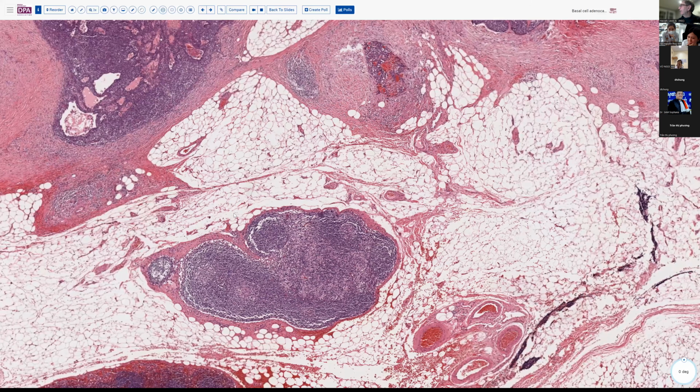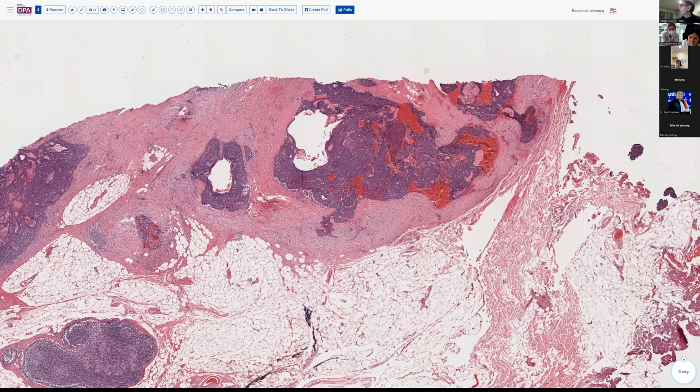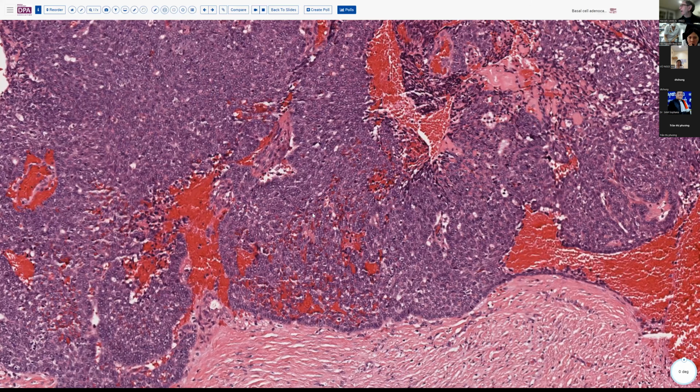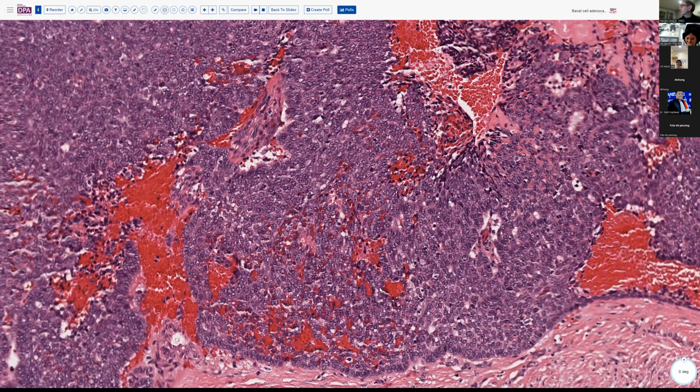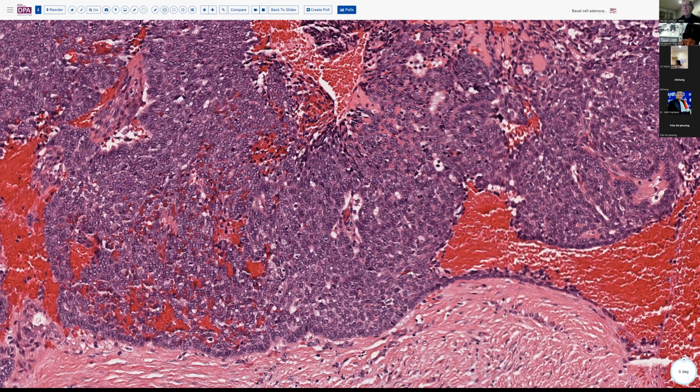But here you can see the pattern of low-grade infiltrative growth with some desmoplasia in response to the tumor. And again, a little tongue protruding through the fibrous capsule in areas here. So evidence of a minimally invasive pattern carcinoma. It is a low-grade carcinoma. And this is what we see. And note also here, this peripheral palisaded pattern is nicely characteristic of the basal cell adenocarcinomas.